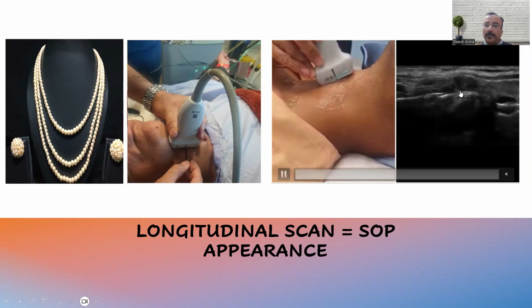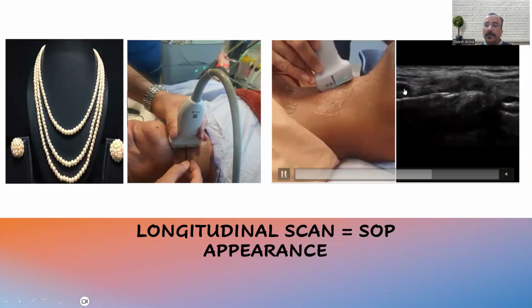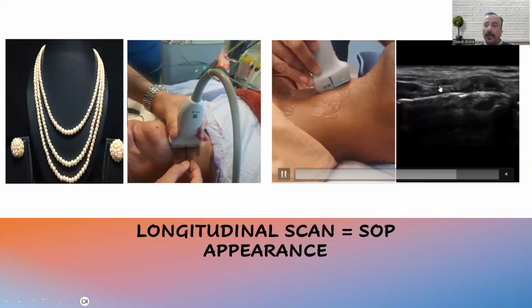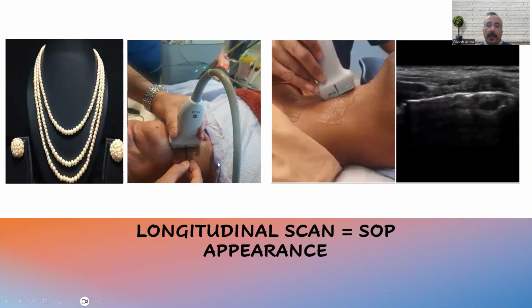The cricoid cartilage appears as a bean shape. The underneath is an artifact. The thyroid cartilage, which is situated cranially, would also appear hypoechoic. The white line, as you can see for yourself, which connects these two cartilages, represents the cricothyroid. Once centered, we can have our needle slide underneath and do a marking with the help of a skin marker.